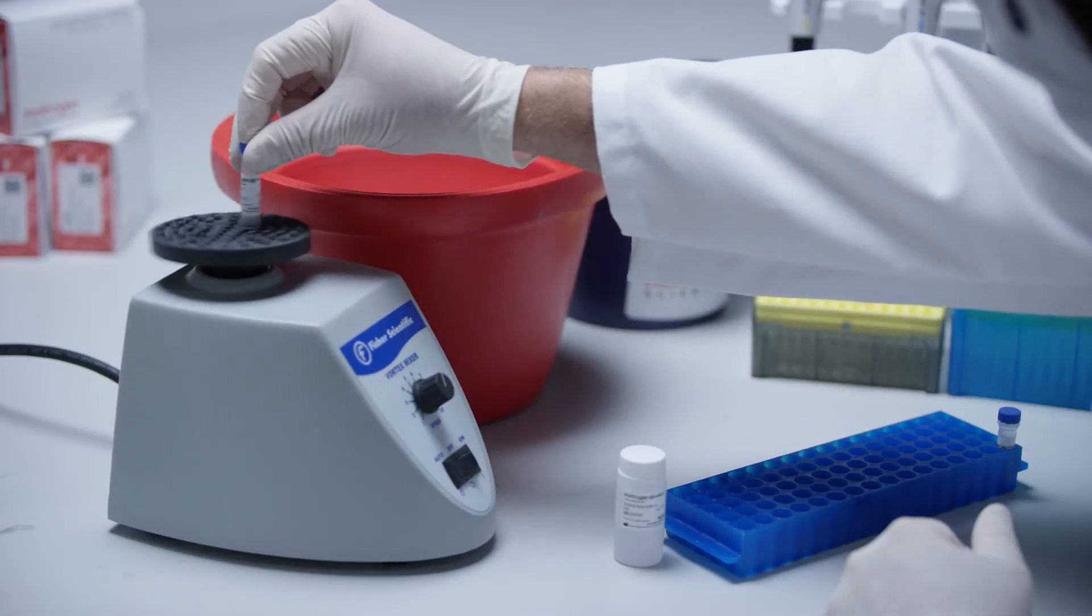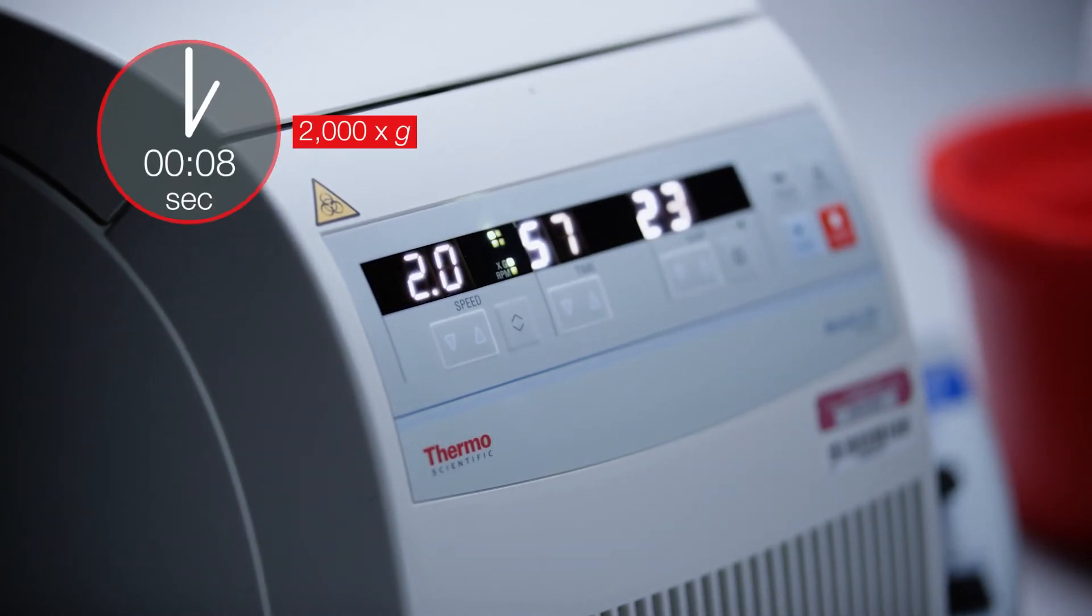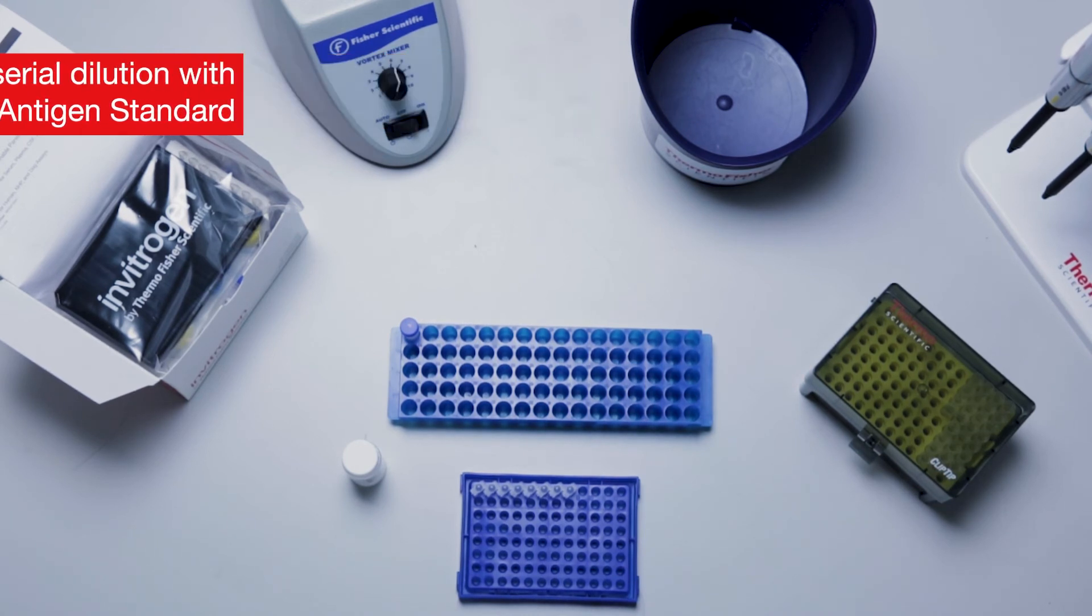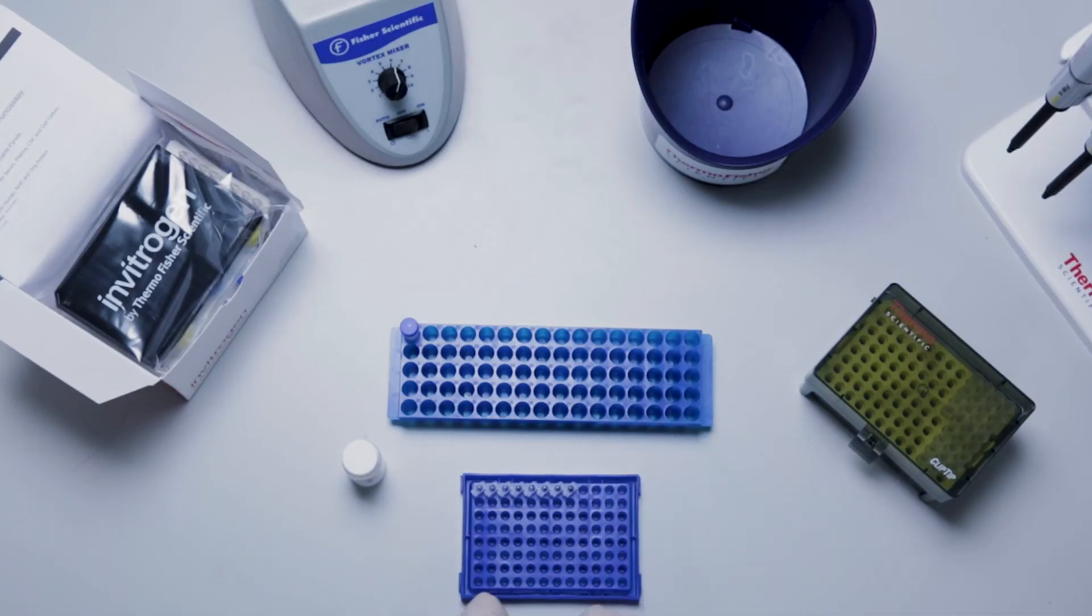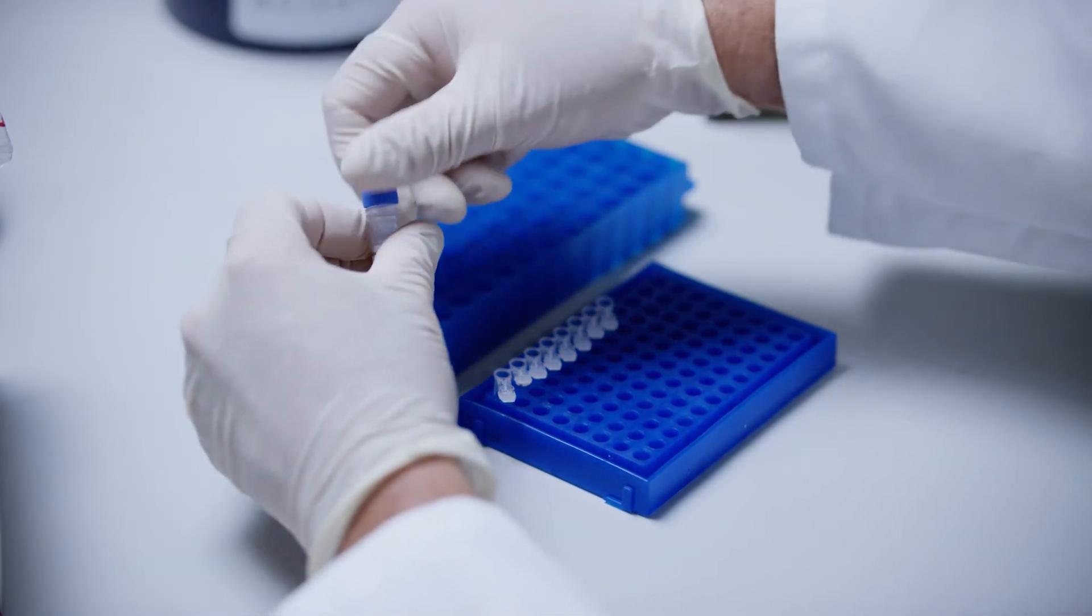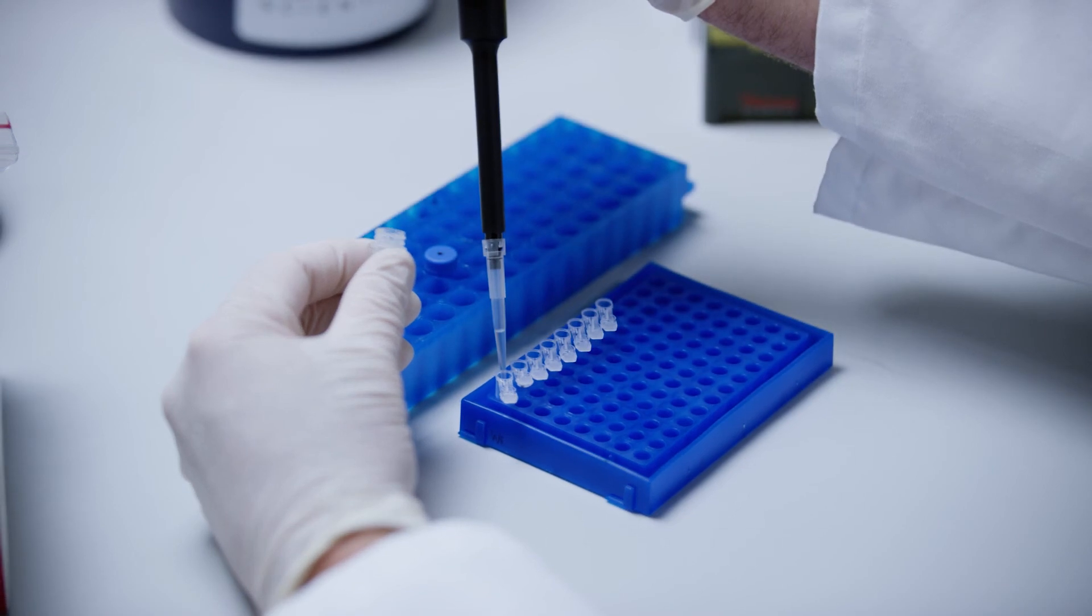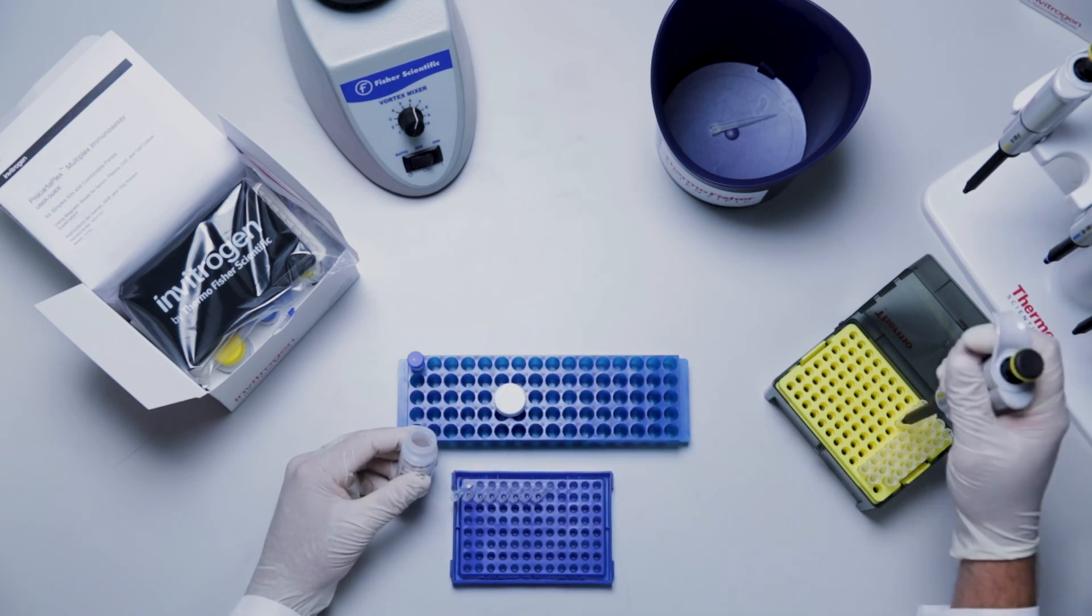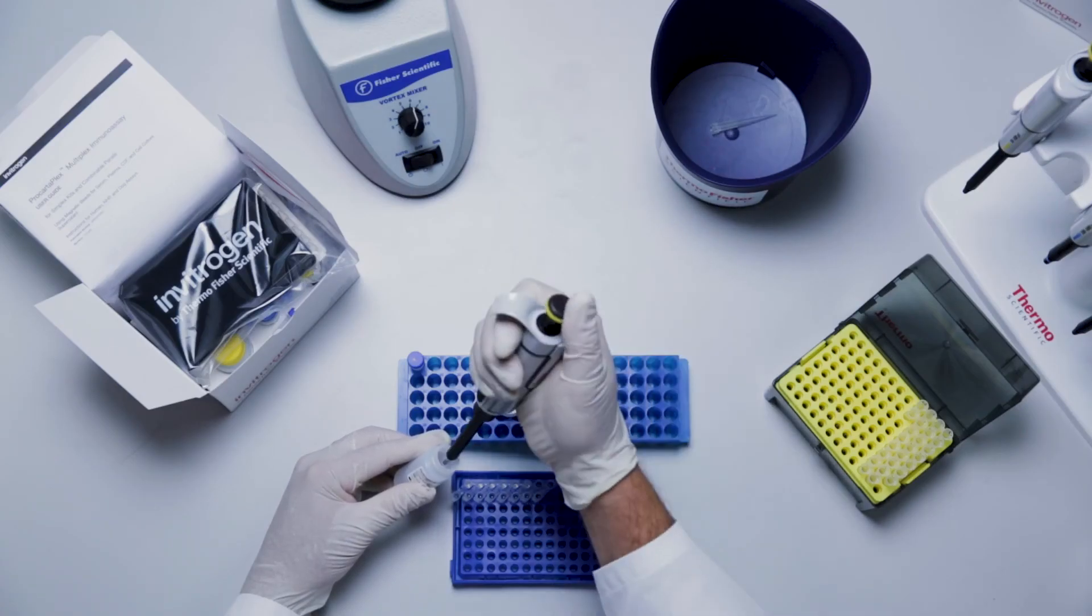Vortex the working antigen standard vial at high speed. Centrifuge at 2000 g for 10 seconds. Prepare a 4-fold serial dilution of the working antigen standard using the 8-tube strip provided. Label the tubes sequentially standard 1 through standard 7. Label the 8th tube for use as a background. Add 200 microliters of the working antigen standard into the first tube labeled standard 1. Add 150 microliters of universal assay buffer or cell culture medium into standard tube 2 through standard tube 7 as well as 150 microliters to tube 8 as a background.